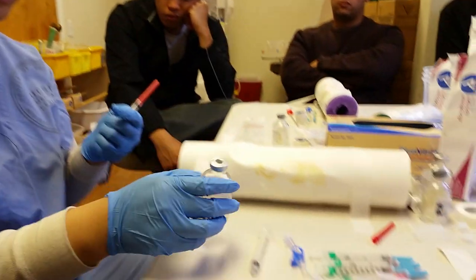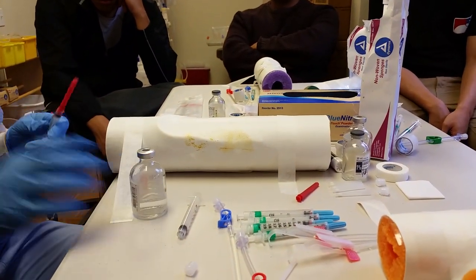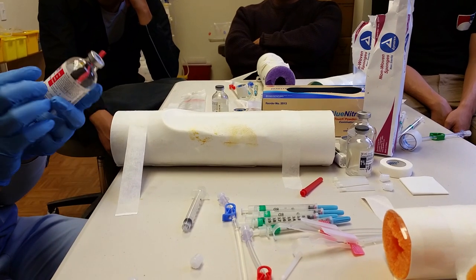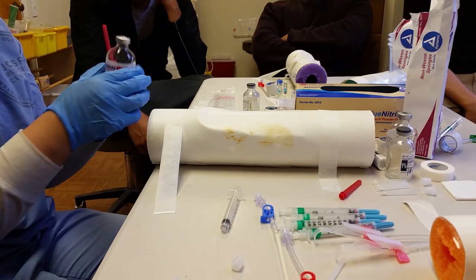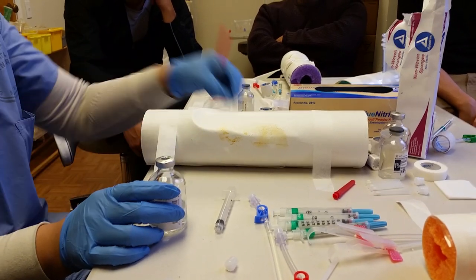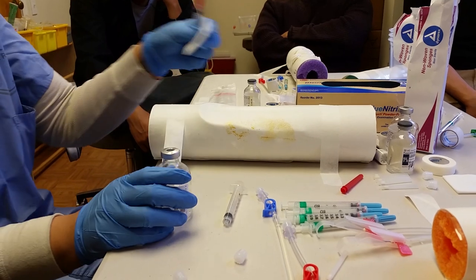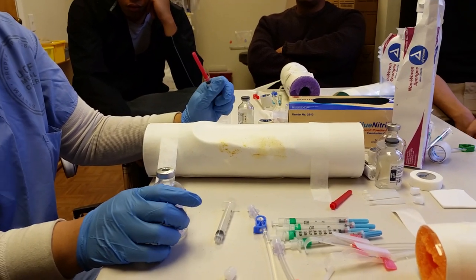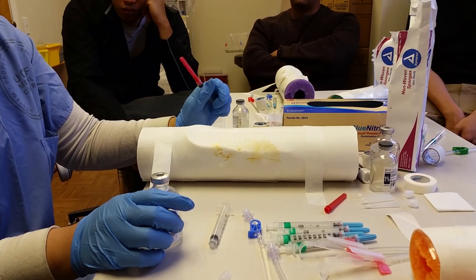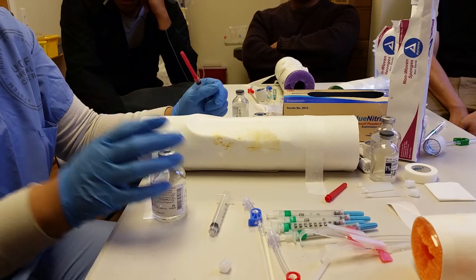And if you're the first person to open it, you initial and date it. So let's say this one's open already — this person signed their name and it's been less than 28 days. But if it's been used already, you always want to clean the top with alcohol. What if the person forgot to sign and date it? I would discard it — I wouldn't take the chance.